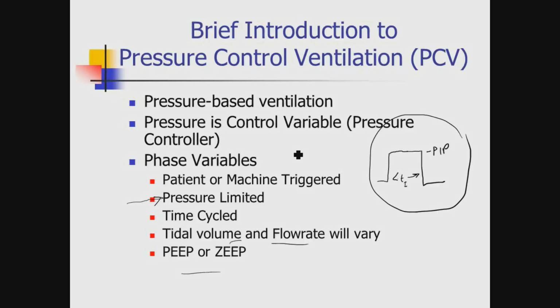So far, so good? Yes, Harleen. What happens when the certain pressure is reached? When we reach the threshold, the pressure stops rising, but the pressure is maintained. It stayed at that pressure. Say it's 30 centimeters: it reached 30 centimeters and it stays there, but the gas flow does not stop.